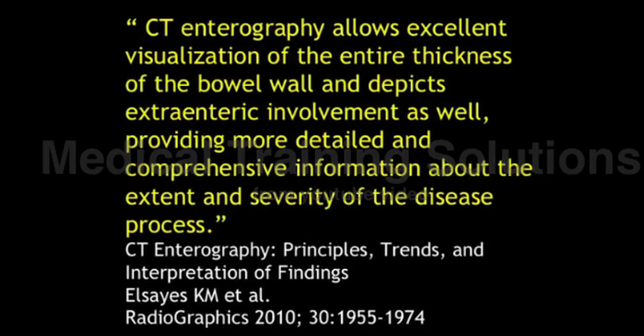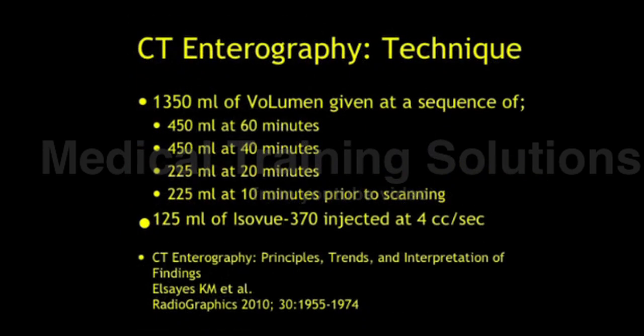And here's a good article from Radiographics. CT enterography allows excellent visualization of the entire thickness of the bowel wall and depicts extra enteric involvement as well, providing more detailed and comprehensive information about the extent and severity of the disease process. Now, in terms of doing the studies, there's a very specific protocol. It will vary depending on the protocol you use. Volumen comes in bottles of 450 cc's. And here's the protocol they used in this one article, where one bottle at 60 minutes, then 40 minutes, then 20 minutes, and then just prior to scanning at 10 minutes, and then they gave IV contrast.